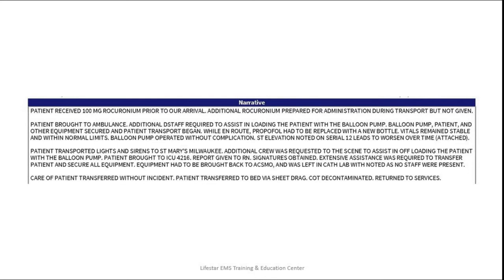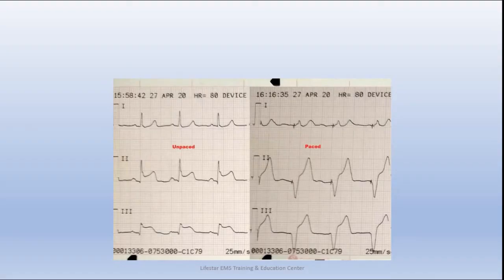And we ultimately transported down to the ICU. The patient was in the same condition when we transferred him as he was when we got him. Unfortunately, there was too much damage to his heart for him to recover from everything that went on, and he did not survive his encounter. However, the cool part of this call, as unfortunate as the outcome is for the patient, is this crystal clear comparison of what pacing does to cover up a STEMI.